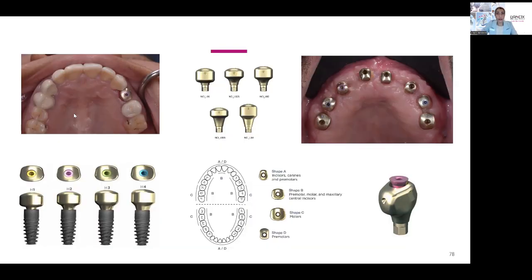During the scanning process, there is an important tip to keep in mind. The iPhysio has a wider side and a narrower side. The wider side should always be placed toward the buccal vestibule. There is a dot on the buccal surface of the iPhysio to help with correct placement of the iPhysio in the patient's mouth.